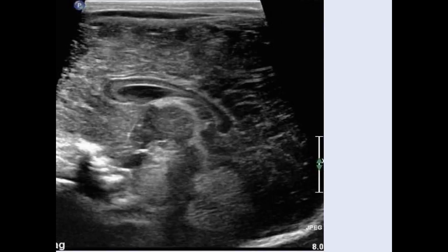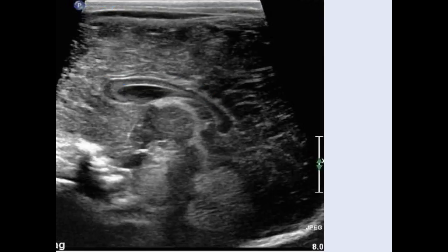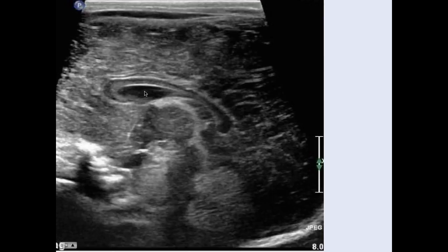Moving to the sagittal planes, this is our straight midline sagittal image. One of the biggest structures is the corpus callosum — it's a hypoechoic band, and this is the normal fully formed corpus callosum. We see it coming from anteriorly, sweeping around, and ending posteriorly. There are certain diseases where we have complete absence of the corpus callosum or it is only partially formed — missing the posterior part or another section. So that's an important structure to assess on the midline image.